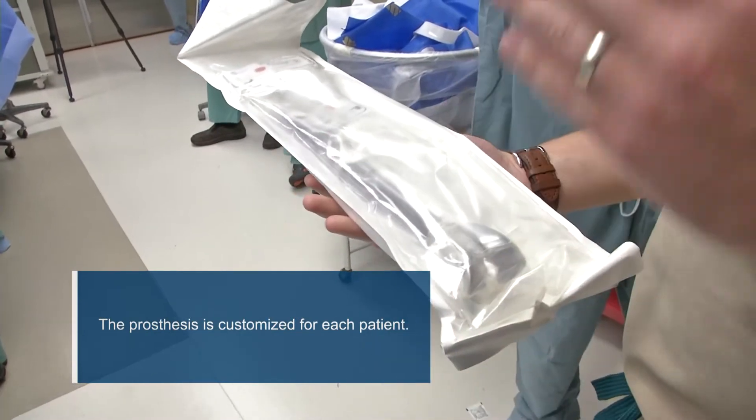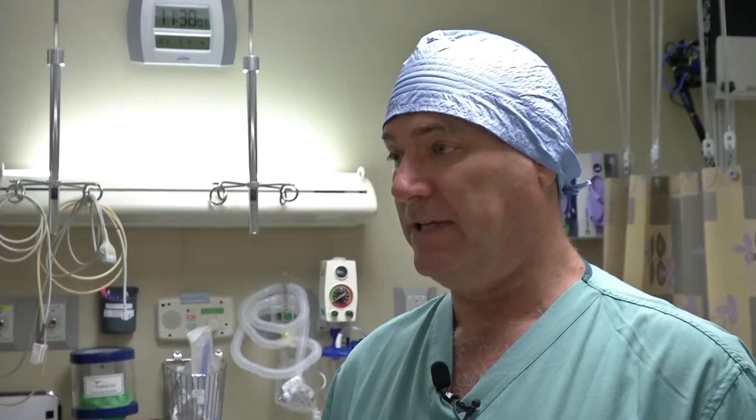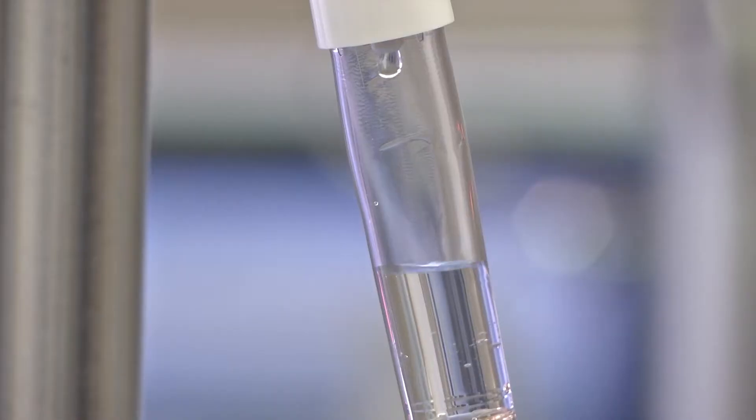To develop this non-invasive expandable growing prosthesis — the replacement for the entire femur, hip joint, and knee joint — that allows us to grow him without doing any further surgery, takes a good two to three months to make the prosthesis.